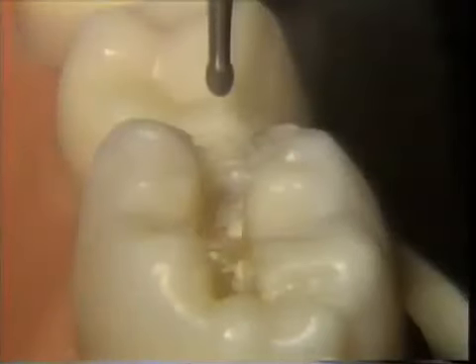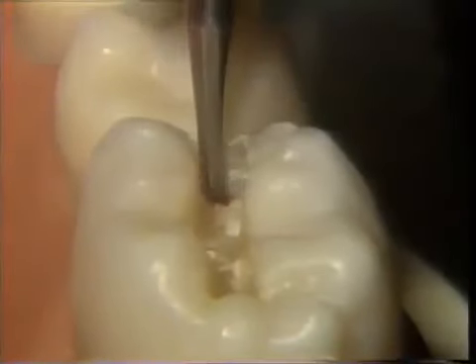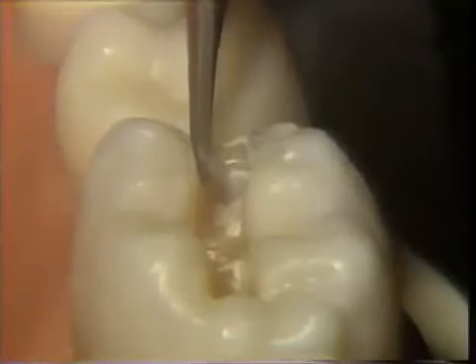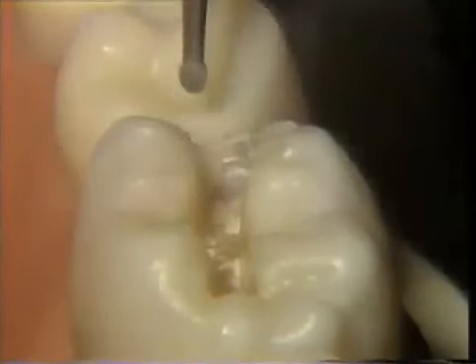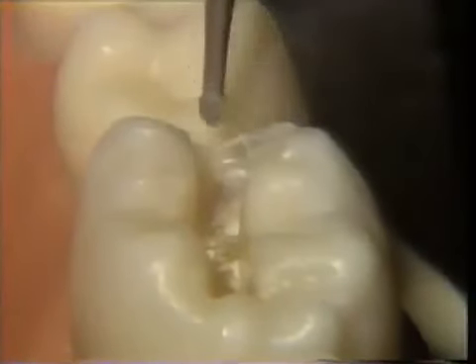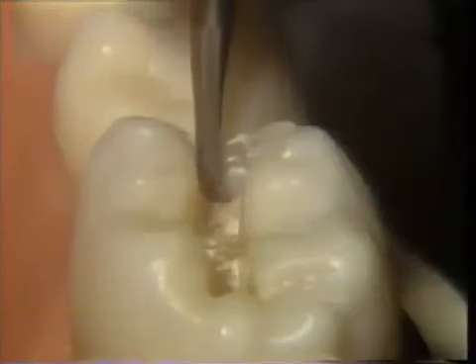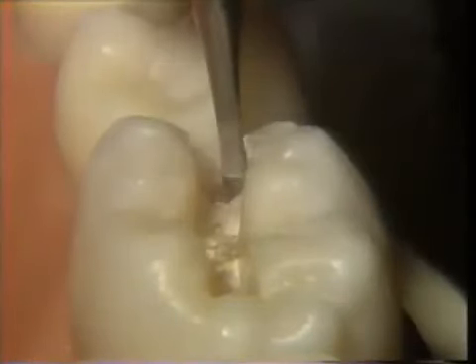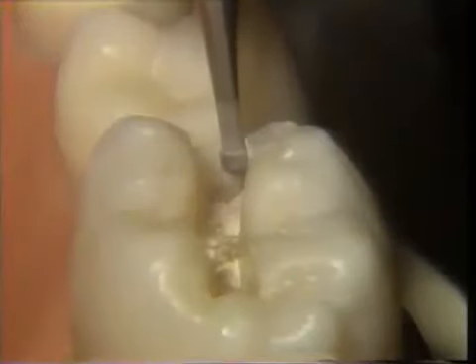With the handpiece running at high speed, the burr is reseated into the point of initial penetration to the established depth and contacting this tissue without cutting. The burr is moved in a buccal direction until the desired extension is reached. After completing the buccal extension, the burr is placed back into the original depth of penetration and the identical movements are carried out in a lingual direction until the desired extension is reached.